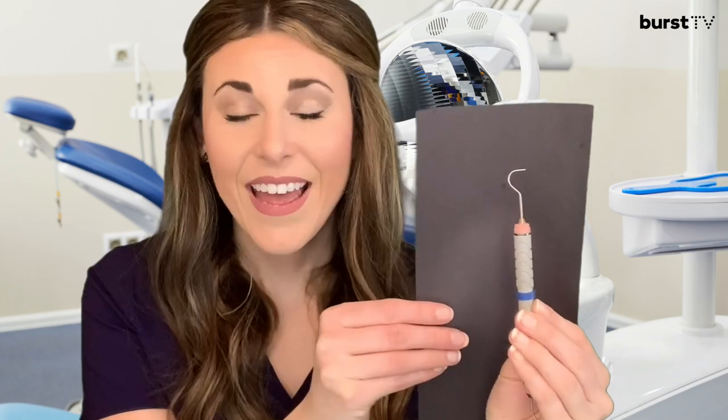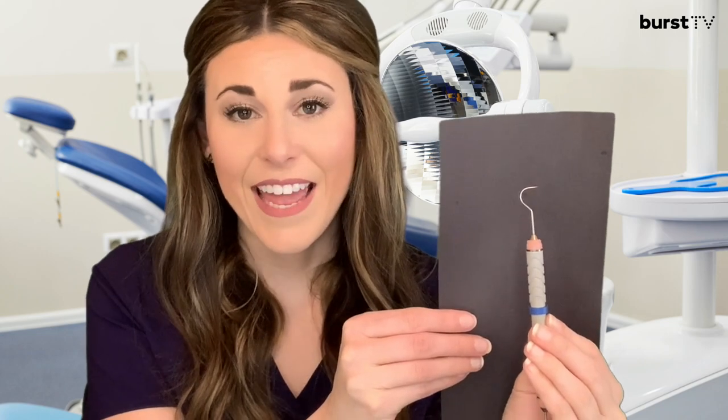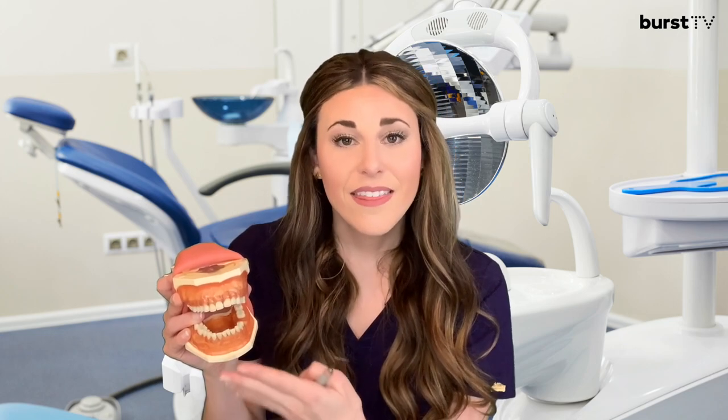The assessment instrument you may be most familiar with is the dental explorer. The dental explorer is used to check for defects in hard tissue and around restorations. My mouth model here doesn't have any restorations, but if he did — such as crowns or fillings — we would be able to use the explorer around those restorations and feel if there were any gaps between the restoration and the natural tooth structure, or if it was loose, things of that nature.